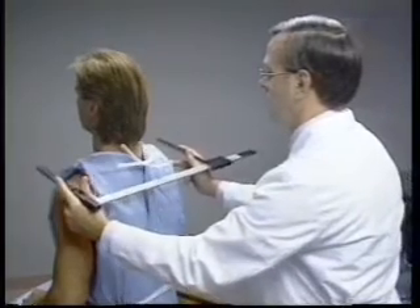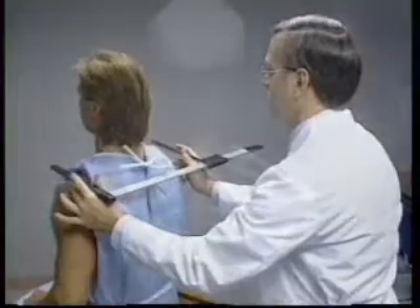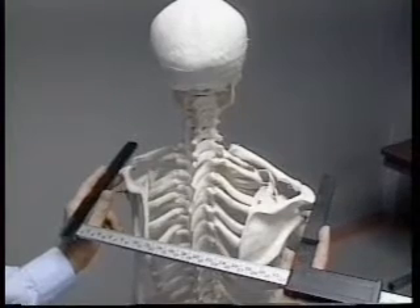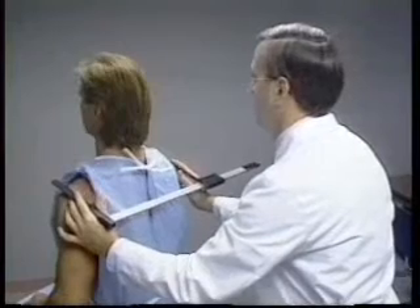The technician uses the middle fingers to palpate the ridges of the acromial processes. When the lateral borders of the acromial processes are located, the bars of the sliding caliper are placed directly on them. The shaft of the caliper is aligned parallel to the shoulders.